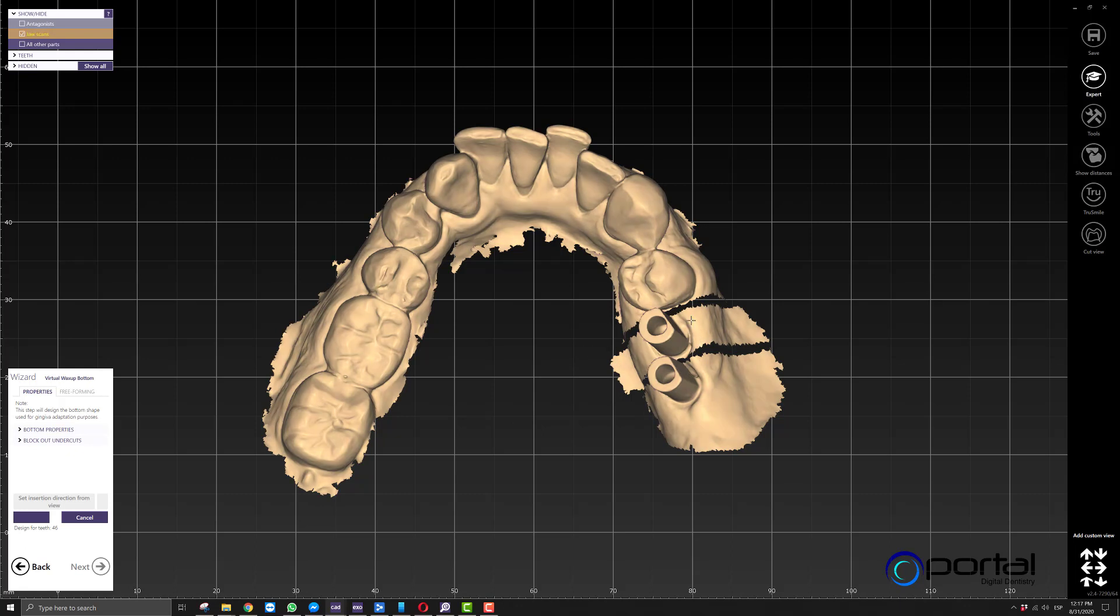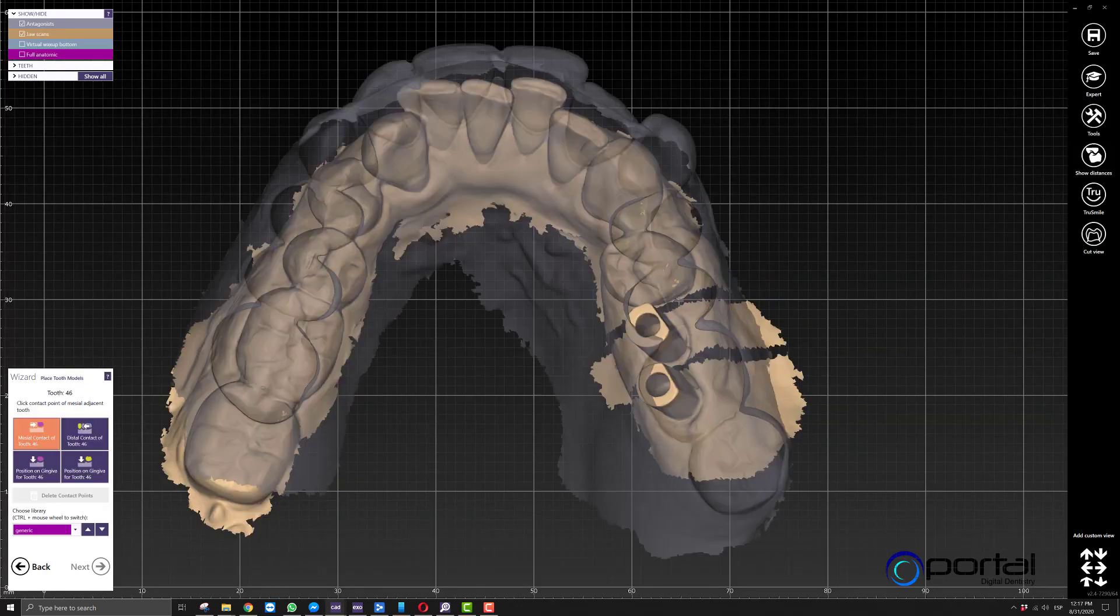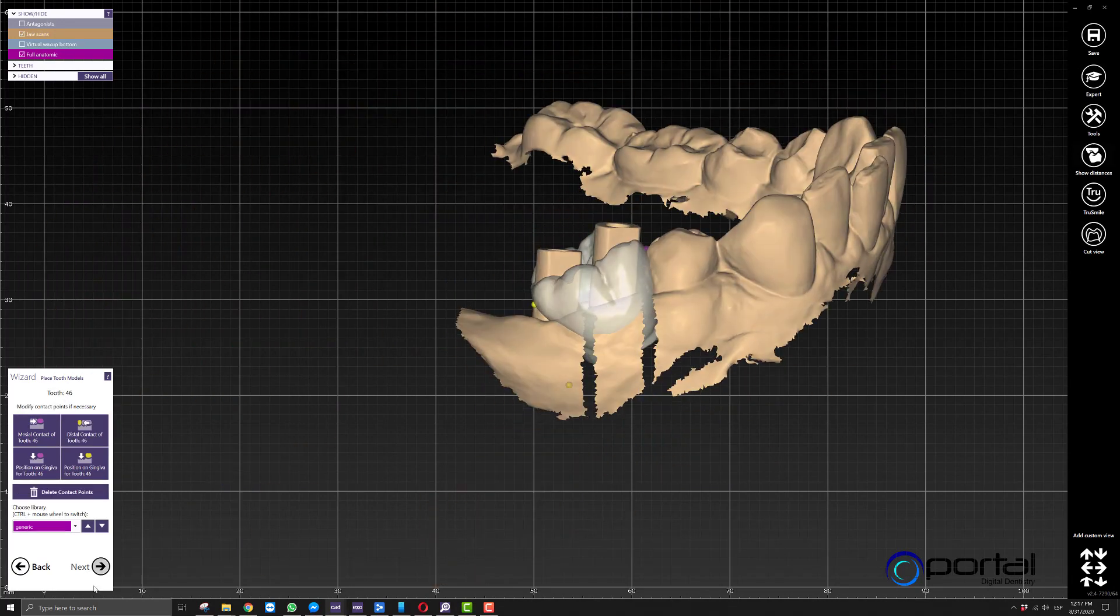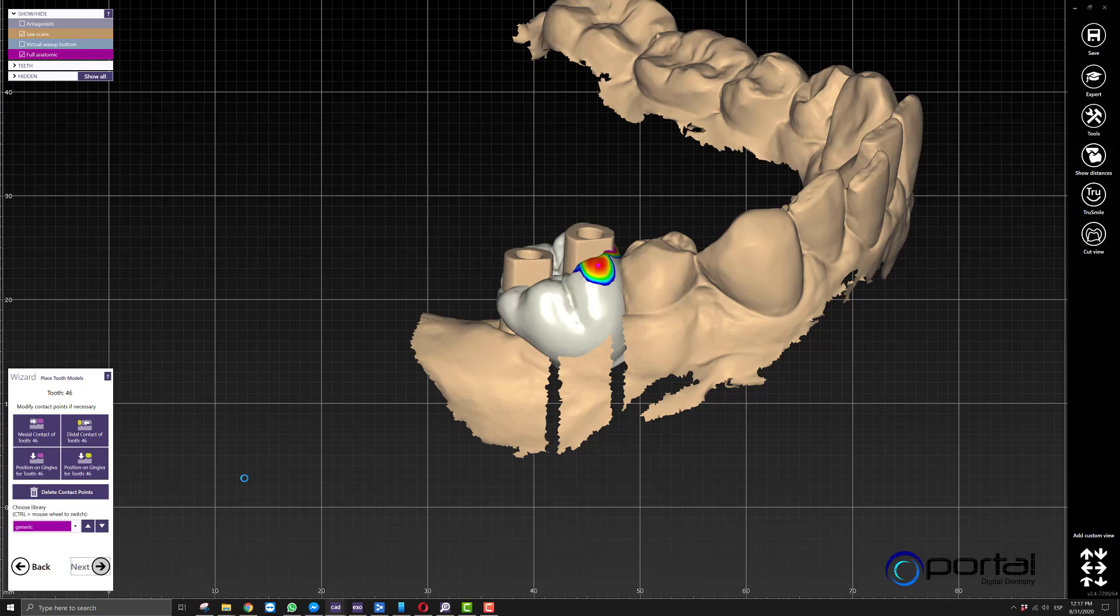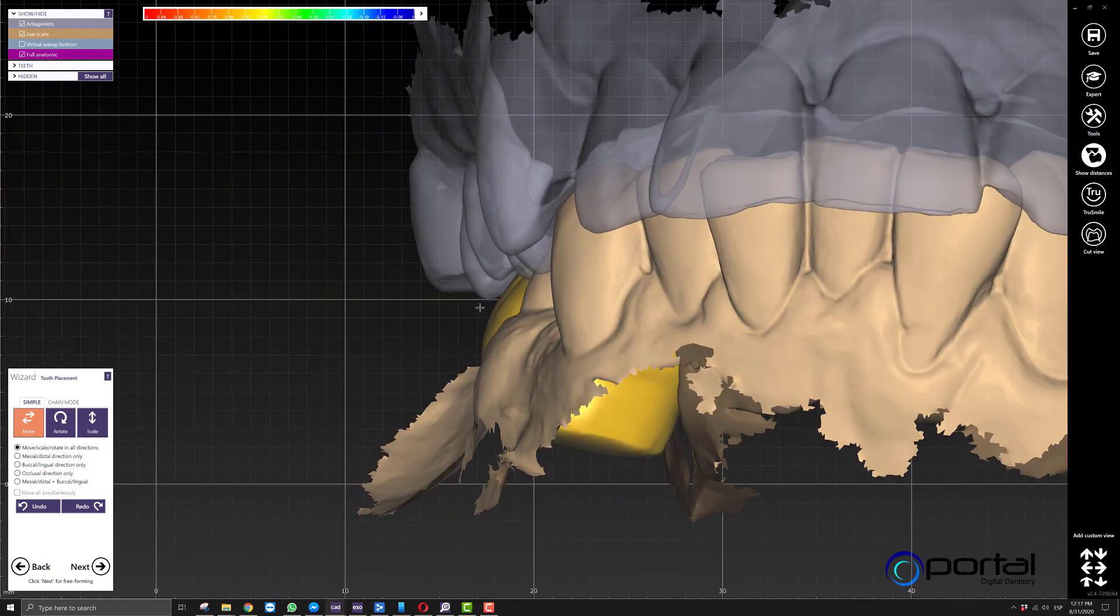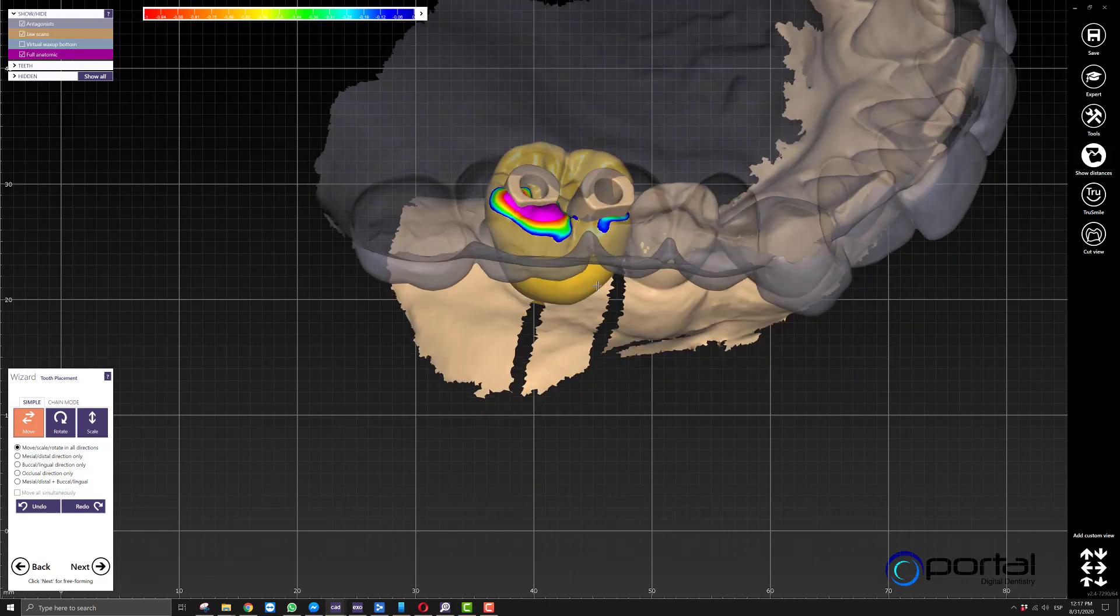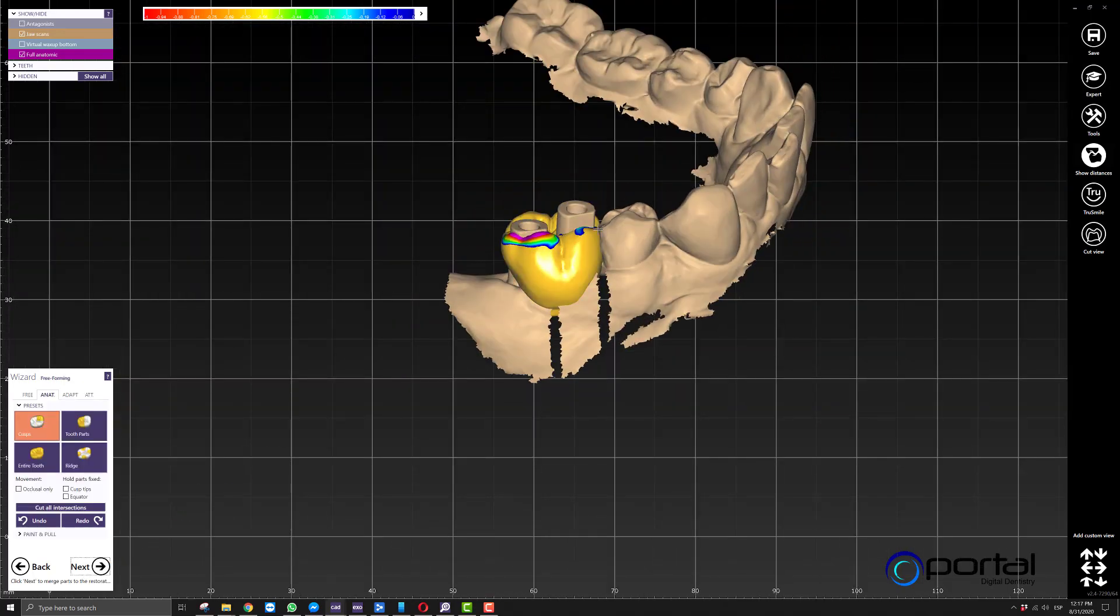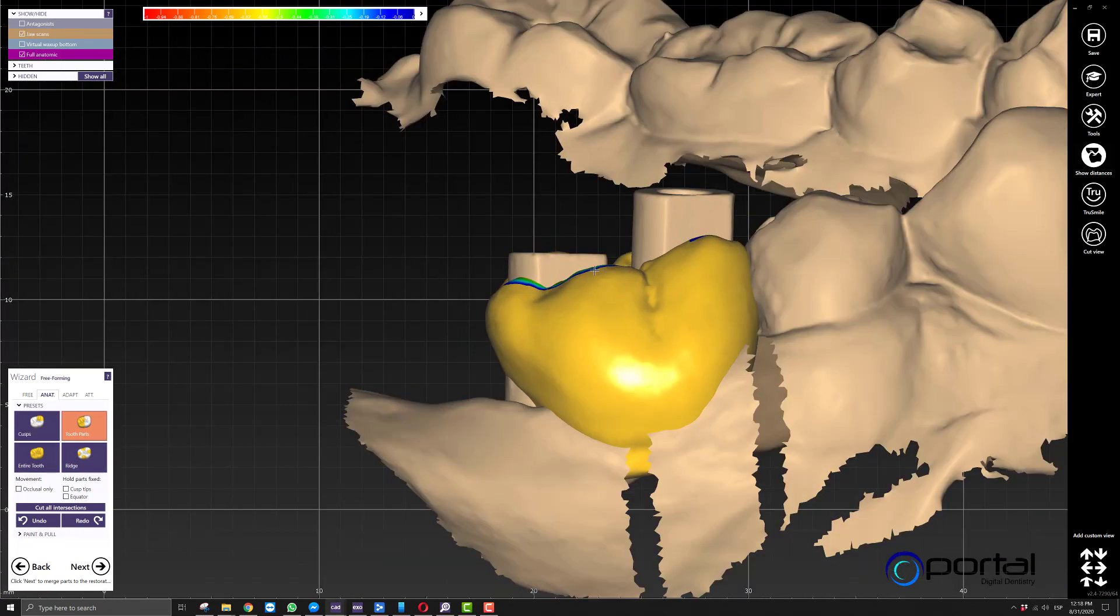Once this is done, we'll get to the step where we'll place our pontic. It will take a bit of time to make sure that's looking great. I'm not going to be overly picky here for demo purposes. In this step, we want to get as close as possible to what the final product should look like, so we'll make sure our occlusion is correct. For demo purposes, we'll assume this is perfect.